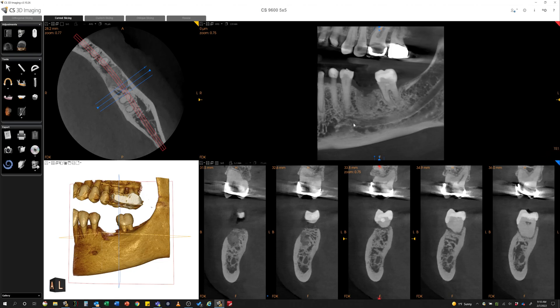The challenge we've had with this in the past is that some folks referred to this as a value indicating Hounsfield units. That's not what this should be mistaken for. It really has everything to do with the brightness or darkness of the pixels that are displayed in the CareStream Dental 3D Viewing software.